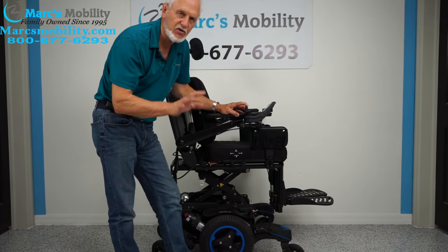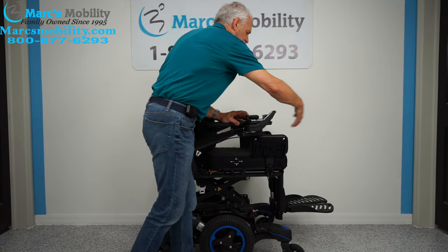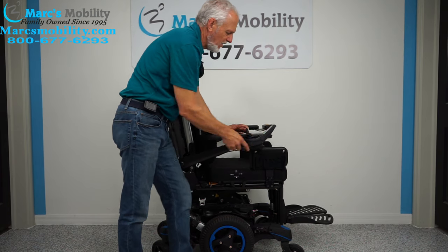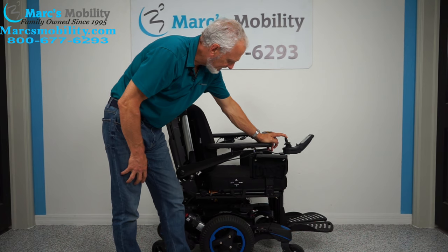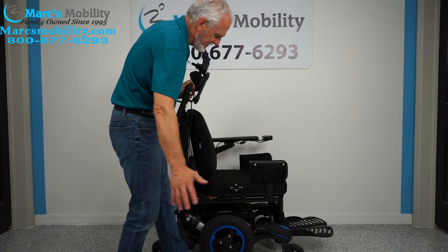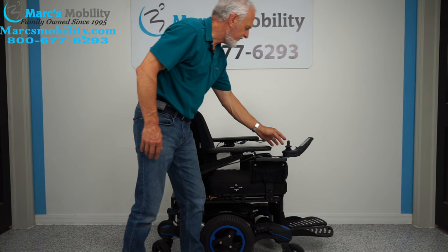This chair has a swing-away joystick, which top-of-the-line expensive chairs usually have, so you can get closer to a table. If you're left-handed and need the joystick on the left side, we can switch everything over with no problem. This chair also has flip-up arms so you can transfer from the side, and the arms are removable.